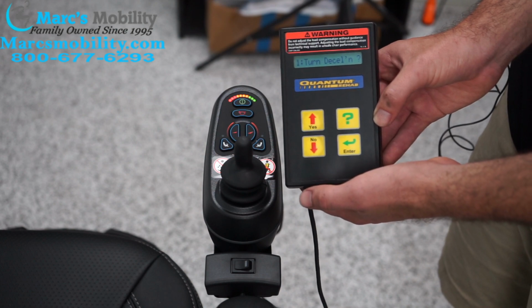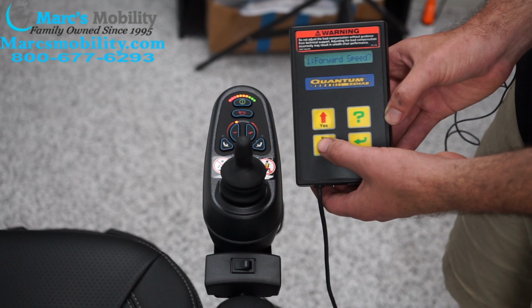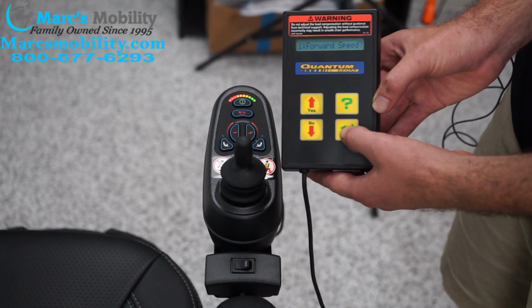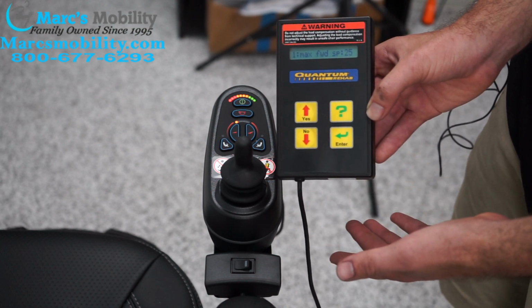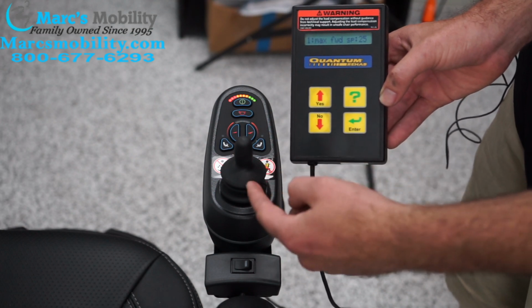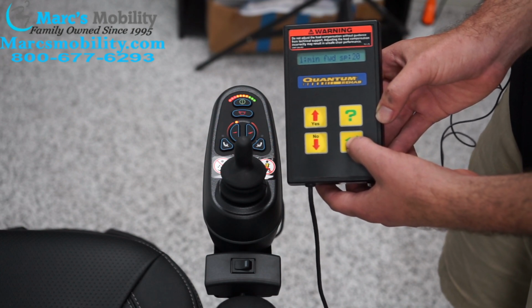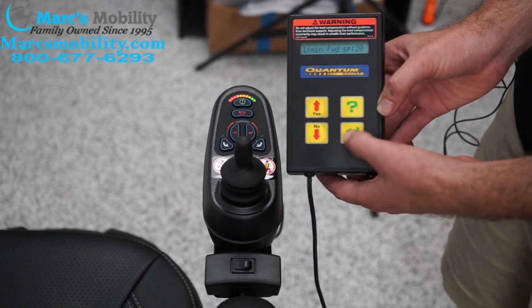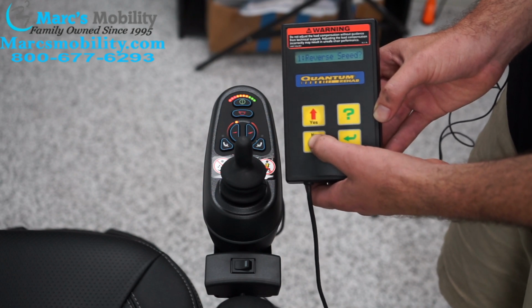Turn deceleration is how fast the chair will stop turning when you let go of the joystick. Forward speed is how fast the chair will go at this profile. So we're on the slowest profile. If I hit enter, it says 25. So this is out of 100. So this is about 1 mile an hour max speed on your first profile. And then it gives a minimum, which is the slowest you can go on this profile at 20. That looks pretty normal to me. I hit enter, and we can keep going through the settings.